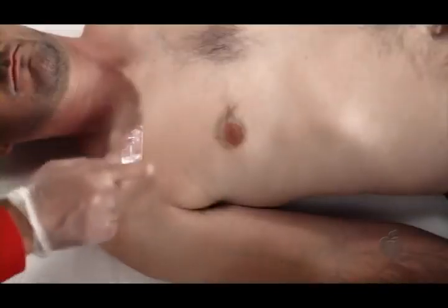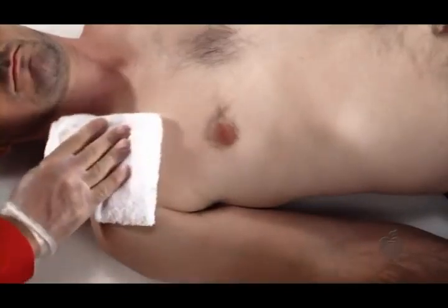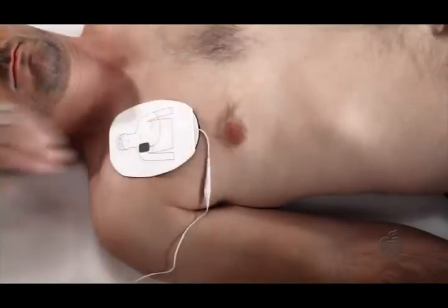Do not place the pad directly over a medicine patch. If the shock delivery will not be delayed, take the patch off and quickly wipe the chest before you put on the pad.